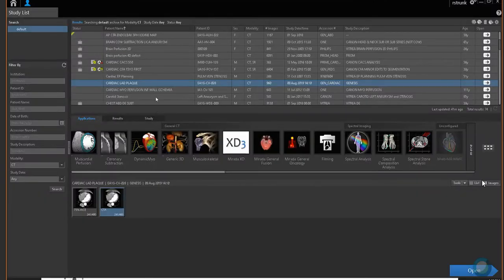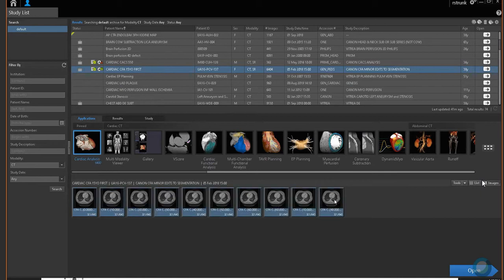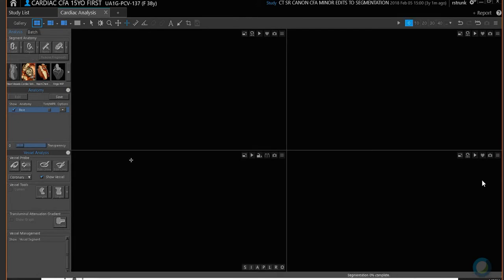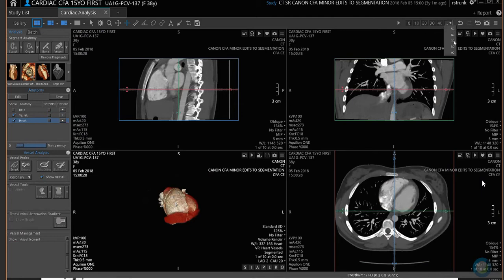For a retrospective study with multiple phases — this one has 10 phases — select all 10 phases for cardiac artery analysis. It will load up all 10 phases; they're all up here in the main toolbar: 0, 10, 20, 30, 40, 50, and so on. You can click on the phase you like, or use the keyboard shortcut F9 and F10 to navigate between phases.